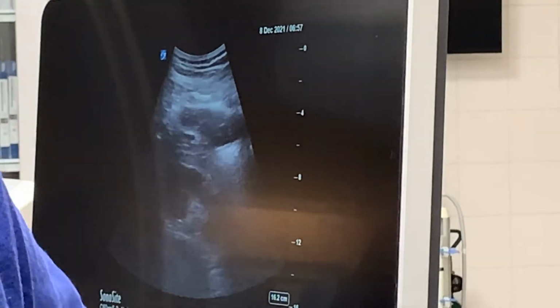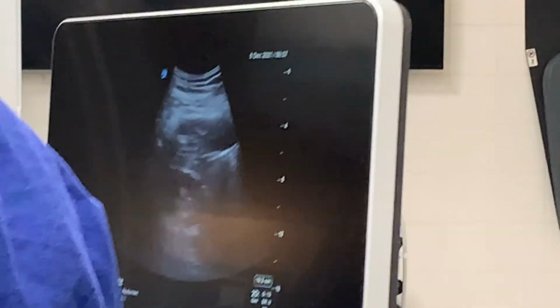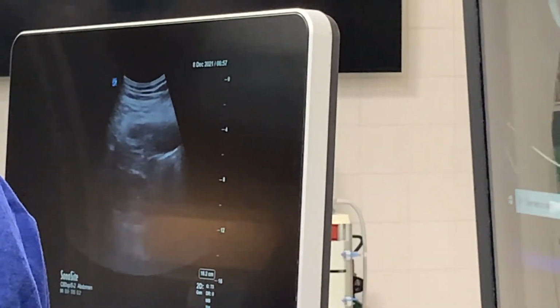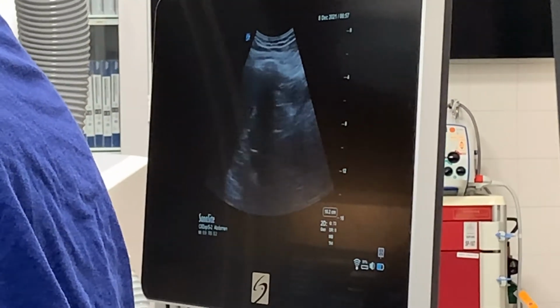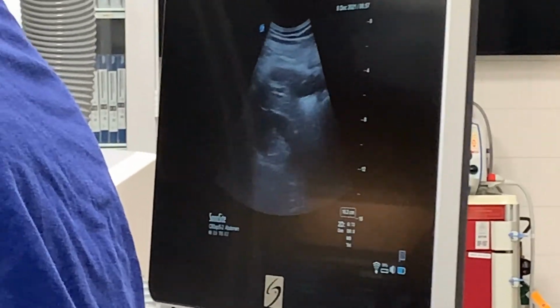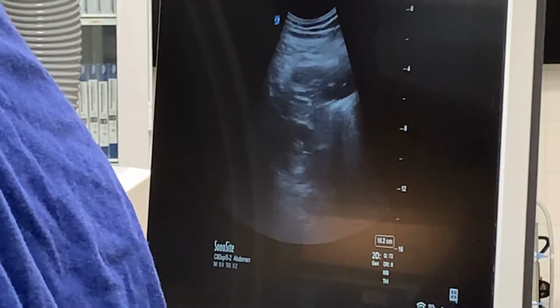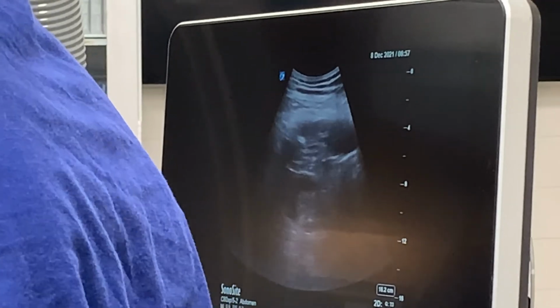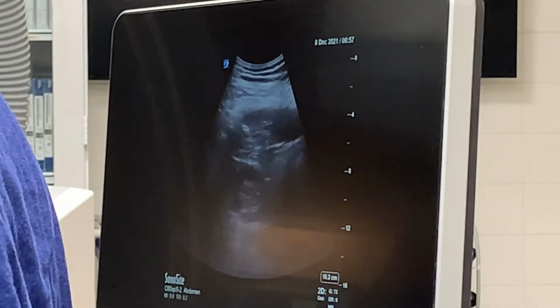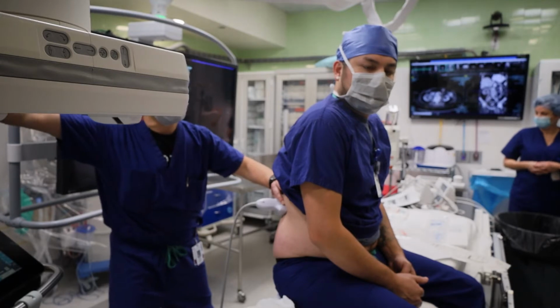Okay, so all of this is digital signal processing, and you have to read the matrix to understand exactly what's going on with ultrasound pictures. If I turn this, now I'm in line with the ribs, and you can see a rib completely in the way. If we were to access the kidney, this would be the relative location we're looking for. Whenever we access things on an ultrasound, obviously I can't put the needle through the center of the probe. I have to put it around the probe, right? So I'm either coming from this angle or from this angle.